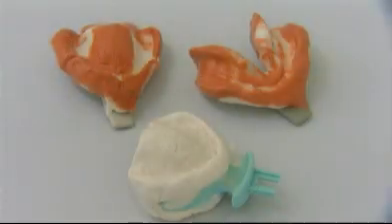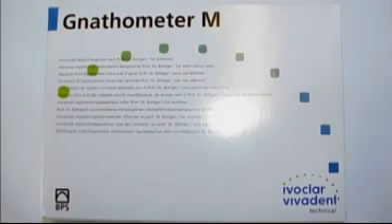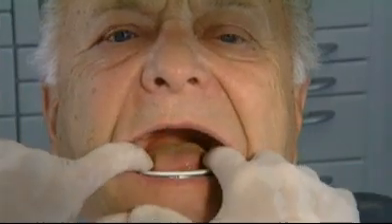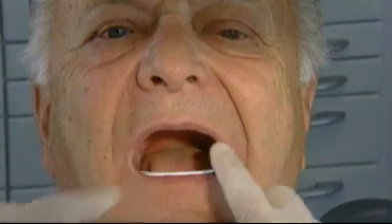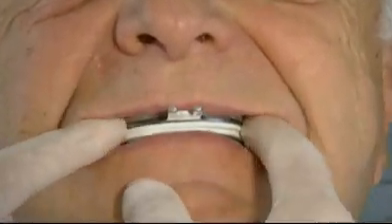The mandibular and maxillary impressions are sent to the dental laboratory together with the centric tray. The gnathometer M with the UTS adapter, the intraoral registration of the Gothic arch, is an efficient way of determining the maxomandibular relationships in edentulous patients. Check the individual trays with the bite rims in the oral cavity. The bite rims should close completely with the load being evenly distributed.